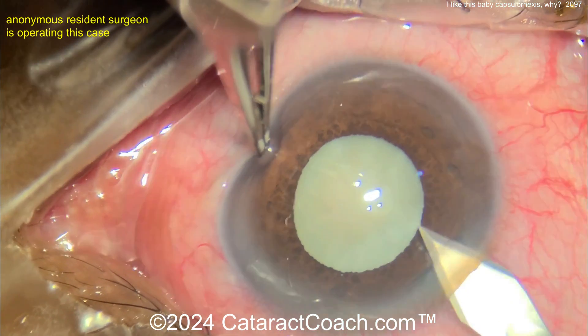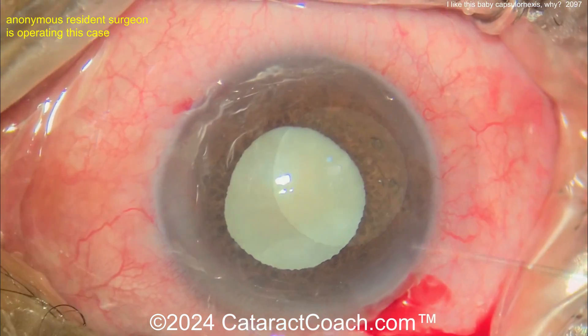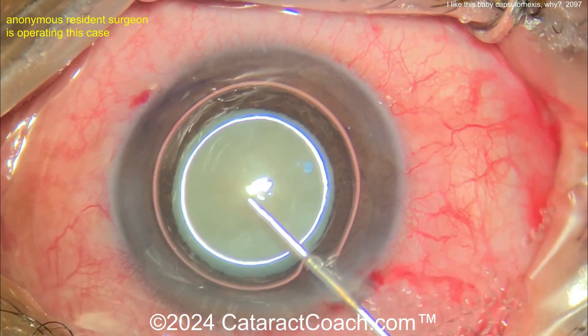I've warned you — when you're doing cataract surgery, you want to avoid that curse of the baby rhexis. We even have a video called 'Curse of the Baby Rhexis' way back from like 2018 on Cataract Coach.